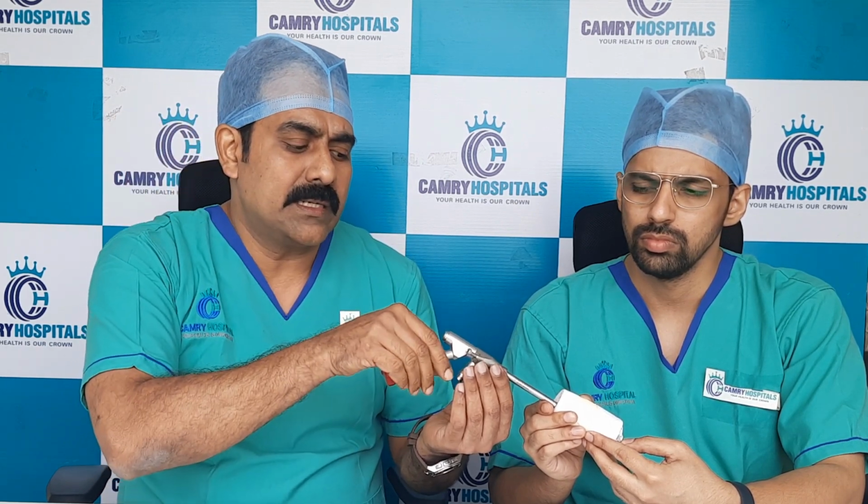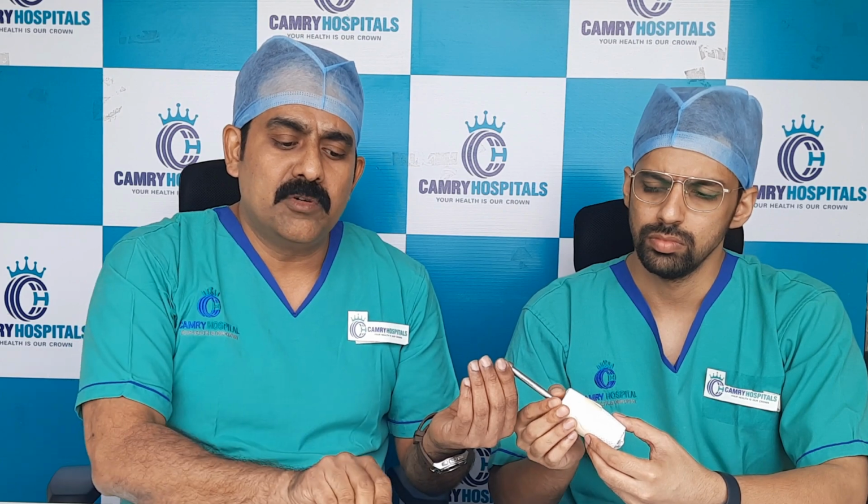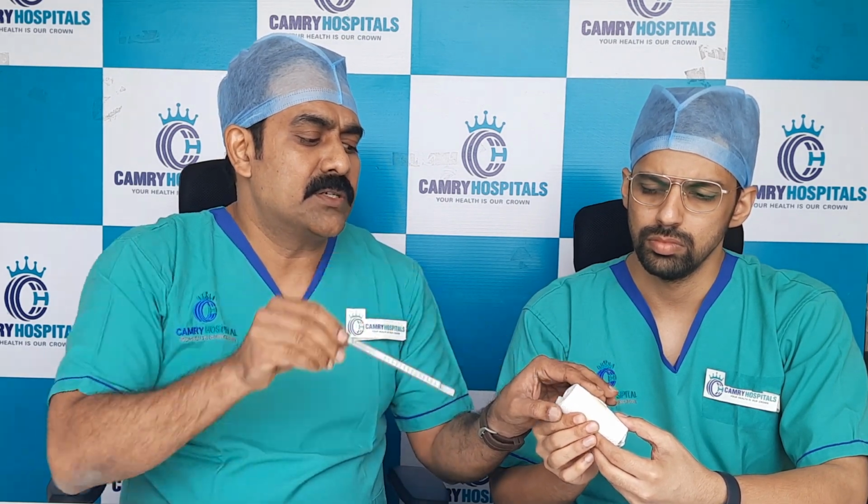And at the end of the surgery, I take the scope out, remove the tissues, and this 8 mm wound, we just seal it with skin glue. So there is no stitch, hardly any scar, especially for young unmarried females, and people who don't want any big scar, and moreover they don't want any wound to heal. No stitches, no tissue cutting, no bone removal. So the tissue just heals in 7 days.